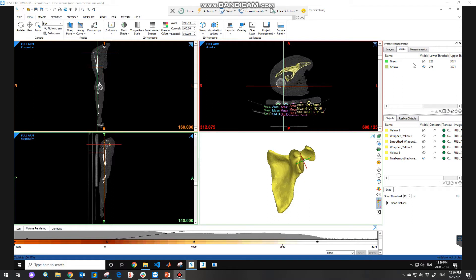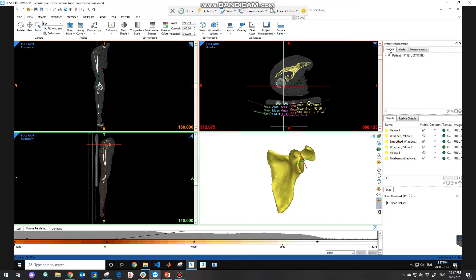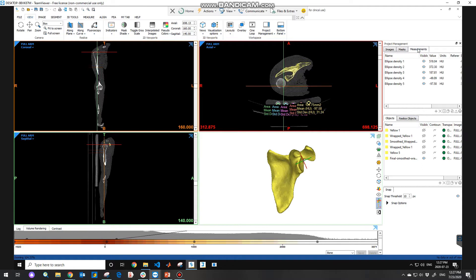On the right hand side of the GUI is the project management tab with three different tabs: images, masks, and the measurements we can make.